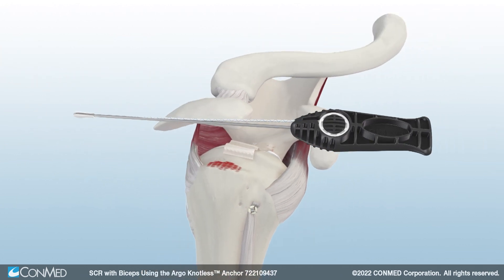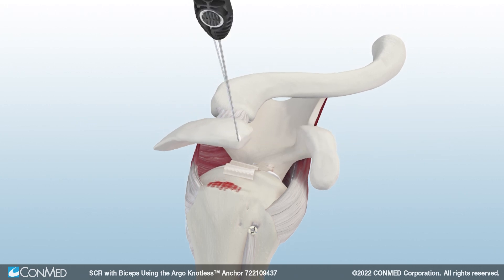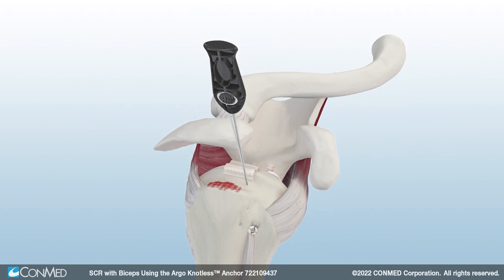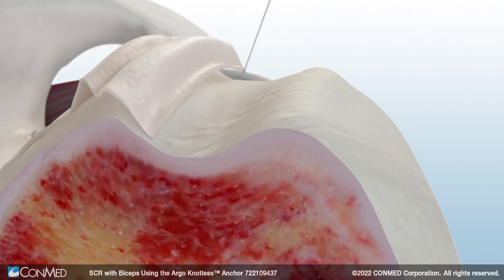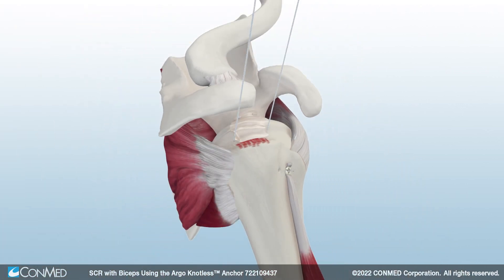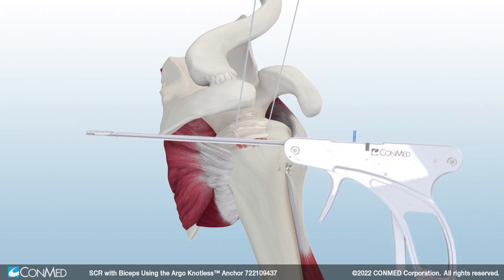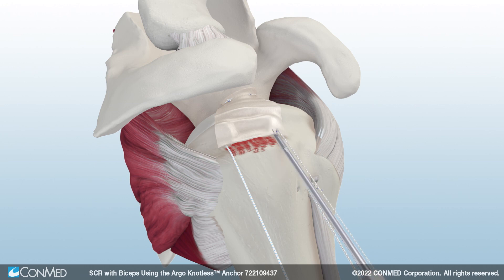Next, insert a double-loaded Y-Knot Pro RC with Hi-Fi Ribbon All-Suture Anchor near the articular margin and remove the driver. Set the anchor by pulling back on all the suture limbs. Then, insert a second Y-Knot Pro RC All-Suture Anchor and set the anchor. Use ConMed's Spectrum Auto Pass to pass all four limbs of Hi-Fi Ribbon through the Allopatch HD in a mattress-stitch fashion.